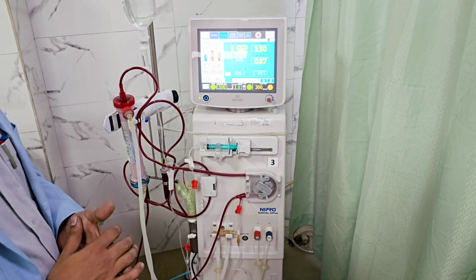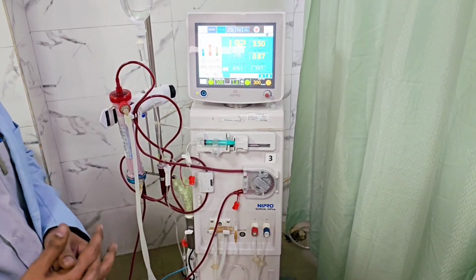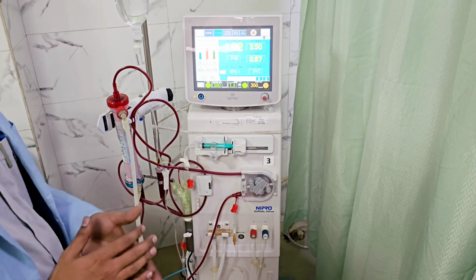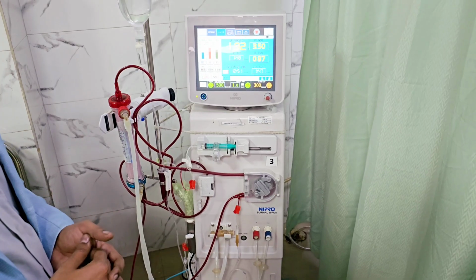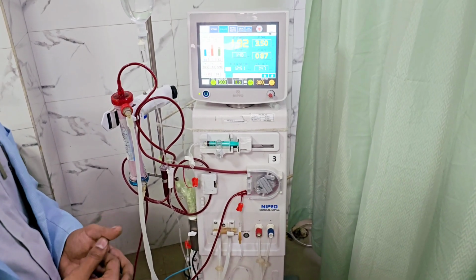During the dialysis session, we have to give anticoagulation in the circuit so that blood won't get clotted. For anticoagulation, we commonly use heparin, where the heparin pump usually delivers the heparin. There are certain patients where there is a risk of high bleeding. For example, a patient who is having uremic coagulopathy has a high chance of bleeding.